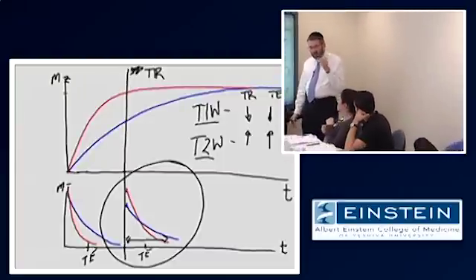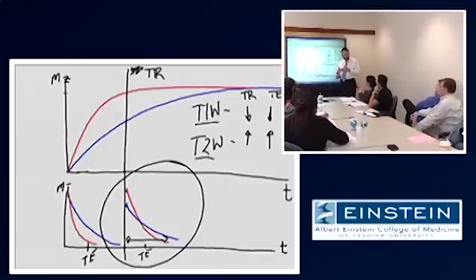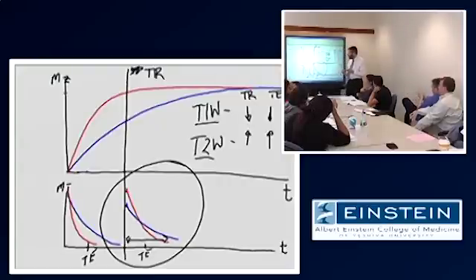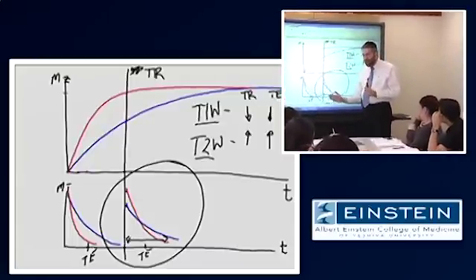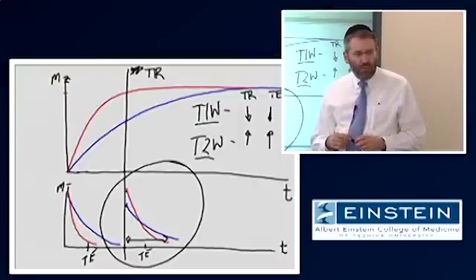Basically the sequence is that we give our RF to generate signal. At some point during relaxation, we measure the signal. And then at some point after that, we repeat the whole thing. That point is TR. When you specify a TR into a machine, is it tied to the TE? Is it TE plus TR, or is TR the time between each? TR is the time from repetition to repetition. TE is the time from the initiation of one repetition until the time at which you measure the signal. Otherwise they're not related to each other. You're not restricted from shortening or lengthening your TE or your TR, other than the fact that your TR really can't be shorter than your TE. Is that clear?